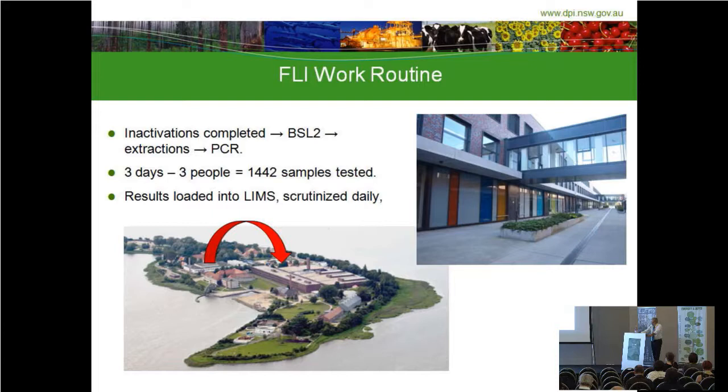Now, in our environment, 1,442 samples in 3 days is not exactly demanding, and so my senior technician came at lunchtime. We'd have a long lunch, he'd finish early. It was a dawdle, as he described it. In an FMD or influenza outbreak at home, he would do 1,400 samples in a day with 2 assistants. So what we're able to show is that we could, in this high throughput format, easily process a large number of samples.